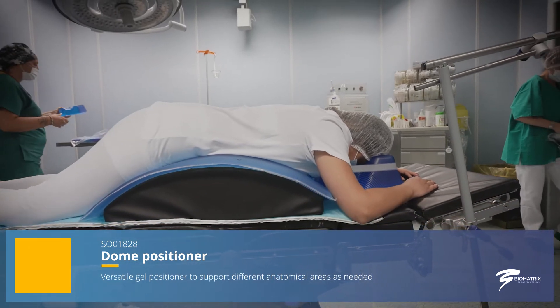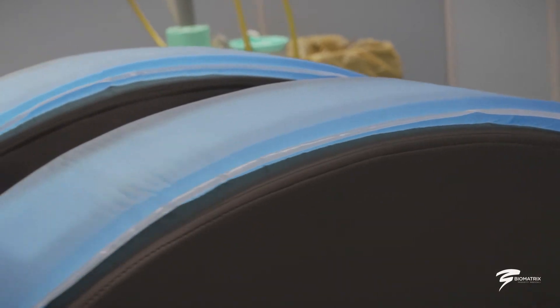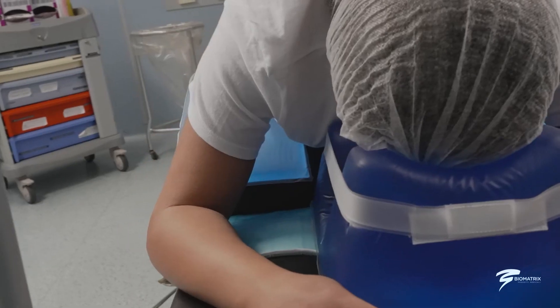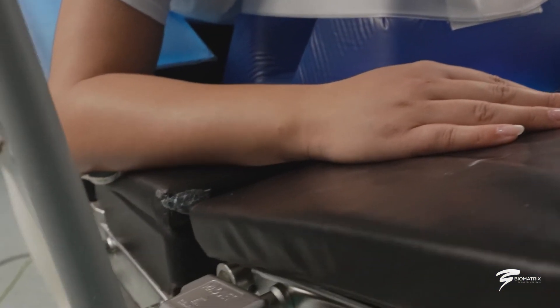Even in the event of accidental cutting or breakage of these devices, the gel does not come out of the wrapping, ensuring greater safety for the patient and the operating field. To increase patient comfort and the prevention of skin lesions, the entire range of gel positioners can be used in combination with disposable polyurethane foam positioners.